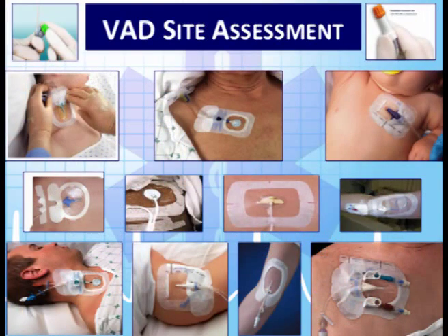So these are central line devices that look really good. Would you agree? Sites look pretty good. They're occlusive, they're dry, they're clean. We have caps on our devices. And there are various devices.